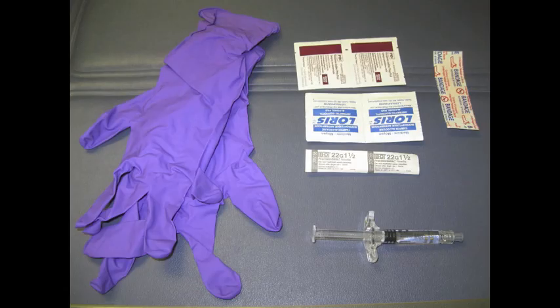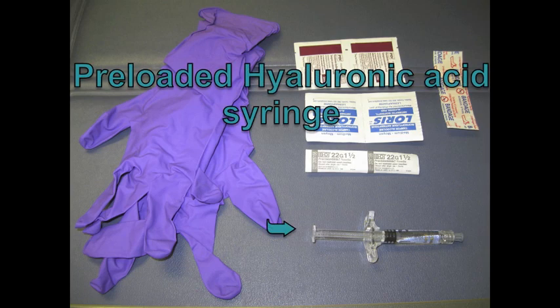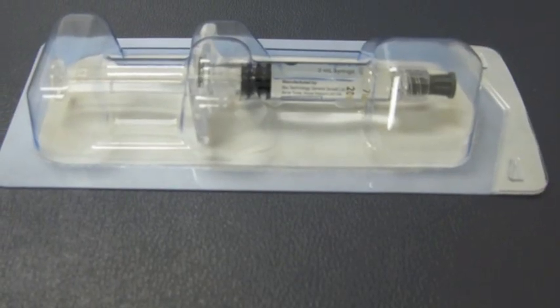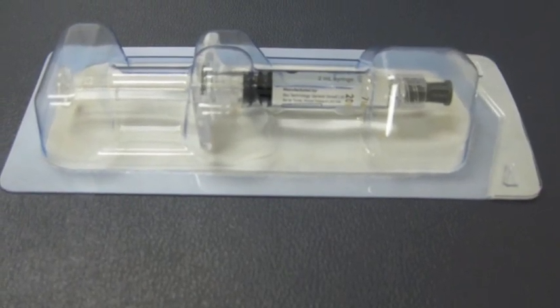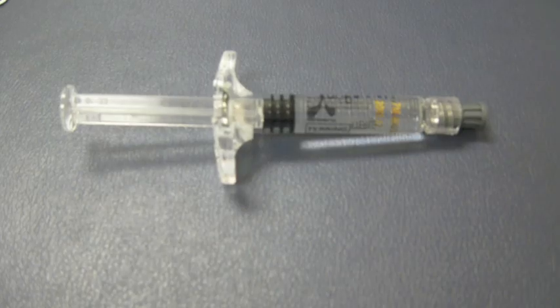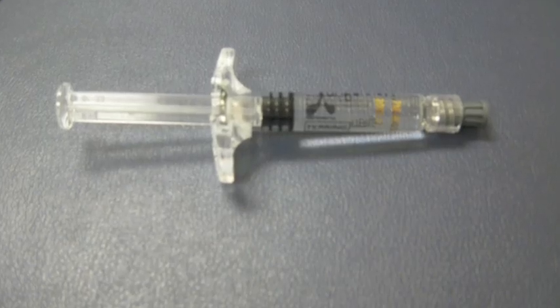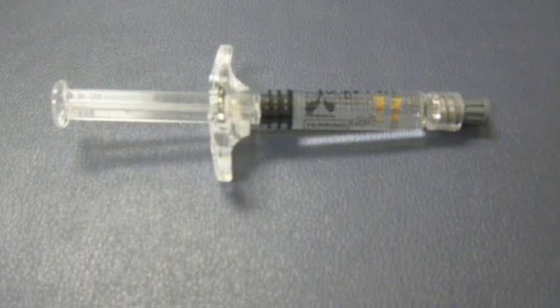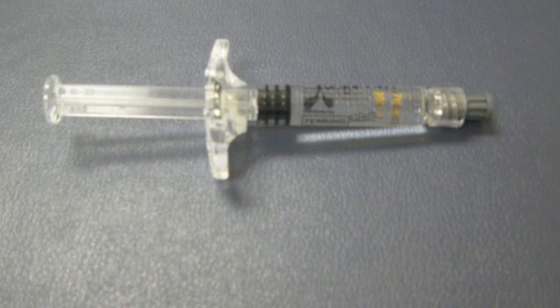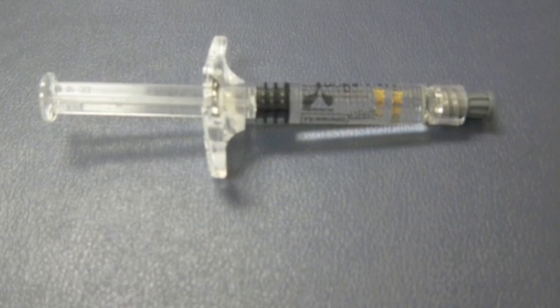The equipment is the same for viscosupplementation, using a hyaluronic acid preloaded syringe. There are different commercial solutions available for viscosupplementation. Some of the solutions are chicken-based. The discussion with the patient will determine which brand is most suitable based on the specific needs of the patient, characteristics of the solution, and presence or not of allergy to chicken.